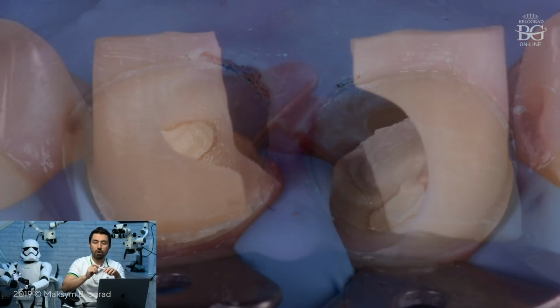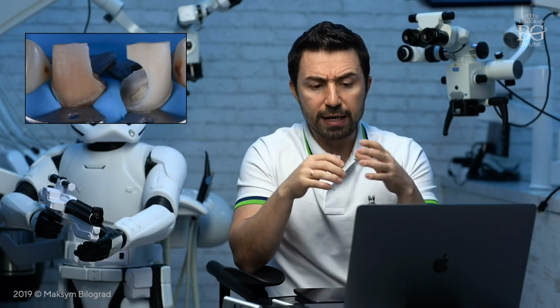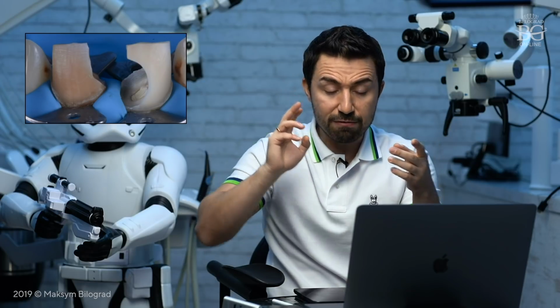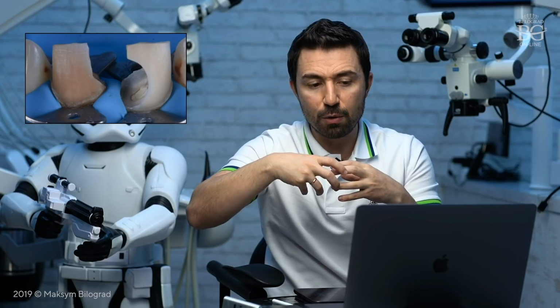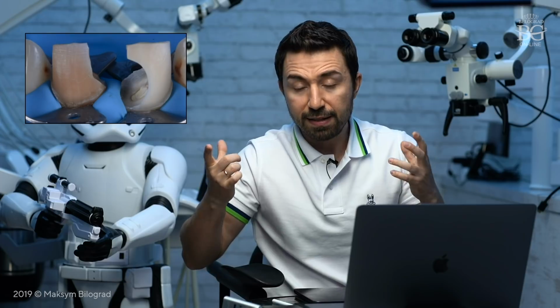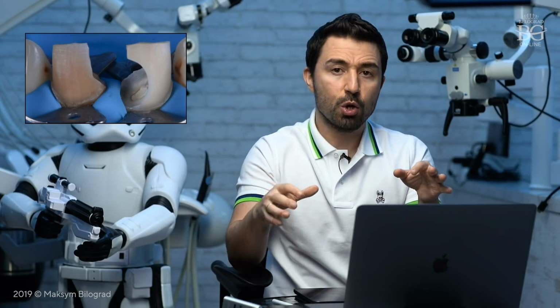Then we do rubberdam isolation, and literally, I don't remember how many rubberdam clamps I tried in that case to get that type of isolation. I tried Brinker clamps, I tried active clamps, I tried modified clamps, I tried everything, but the problem was that the clamps were not stable on the teeth, and they were jumping out from the surface of the tooth because of the pressure of the rubberdam. Then accidentally I found that a regular clamp number 0 was perfect.